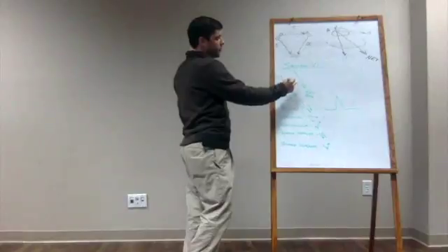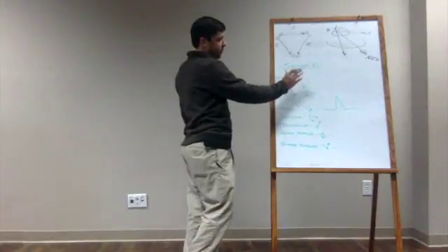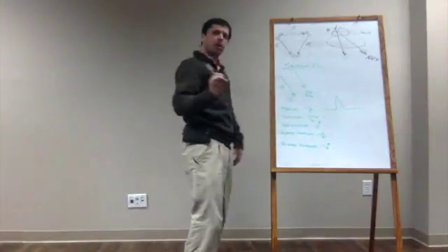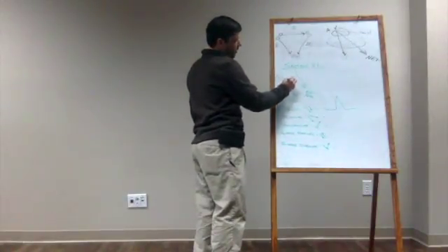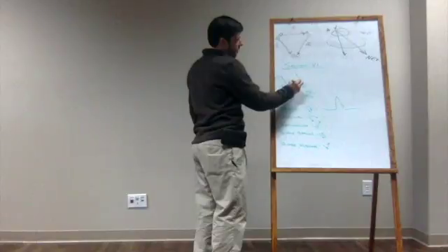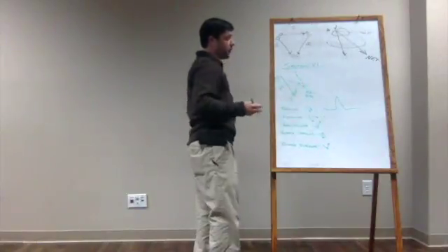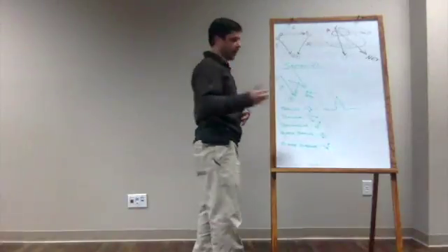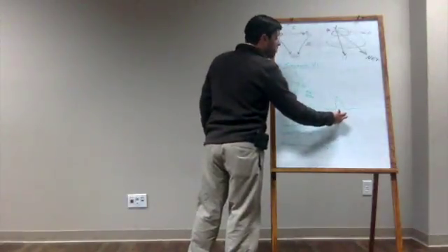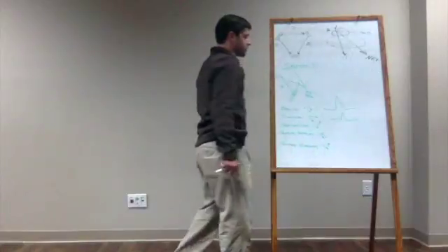And diagonal movement is still moving towards our positive lead, but not in a perfectly parallel fashion. It'll take something along these lines, maybe something like this. But when that occurs, you still get a positive deflection, just not one as perfect as parallel. So it'll be kind of a medium positive deflection.